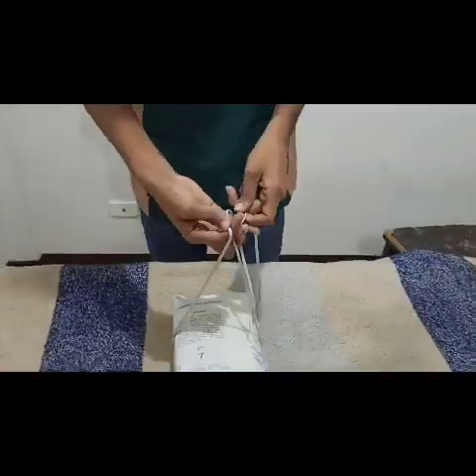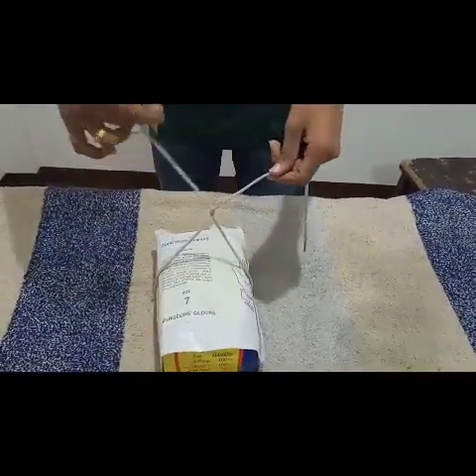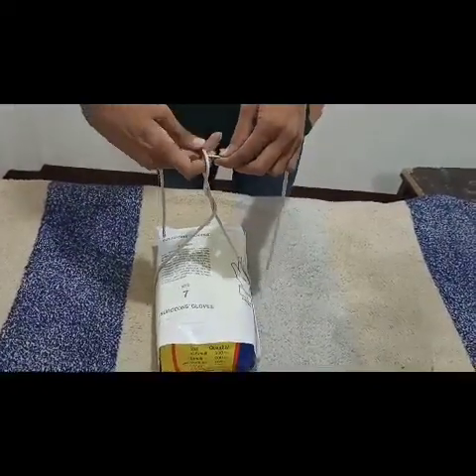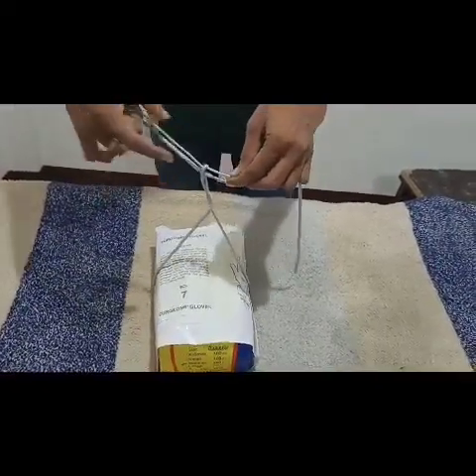Now we are going to perform one hand knot tying. Now we are going to perform two hand knot tying.